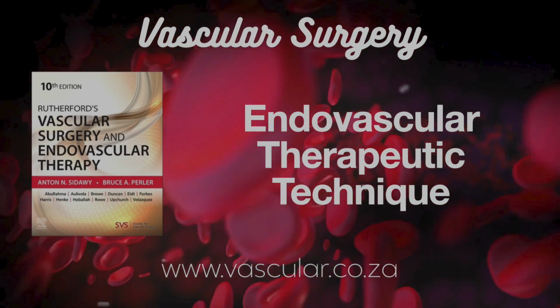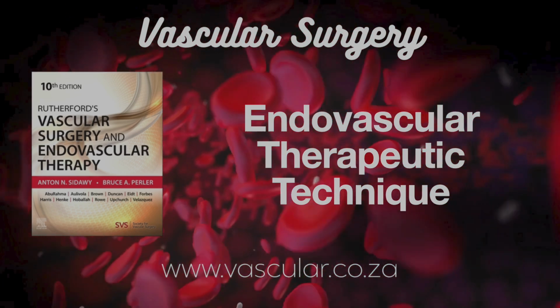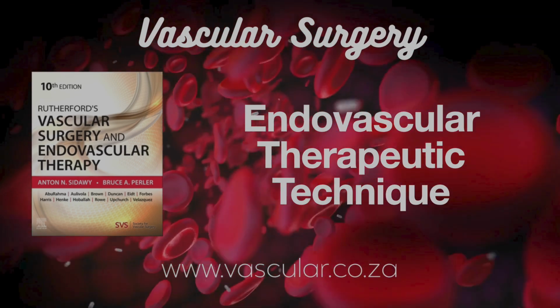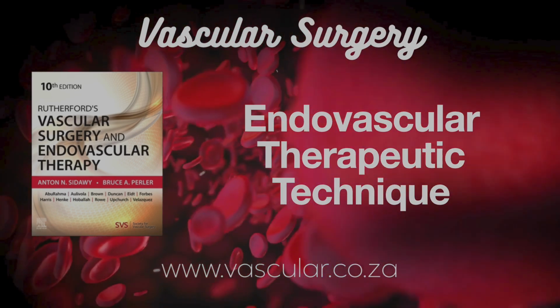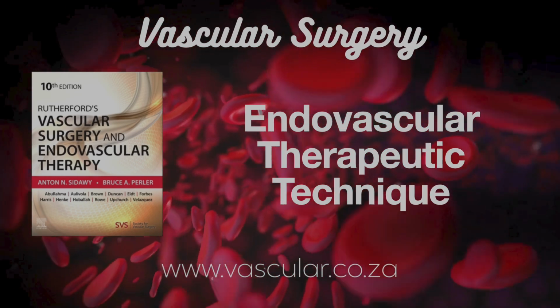Not the whole length, then? Not at all. And these are often used with really fine wires, 0.014, 0.018 inch. They're particularly useful for treating lesions below the knee, where the arteries get much smaller. And the advantage there? Well, a key insight is that the RX design allows for quicker balloon exchanges because the wire isn't running the full length.